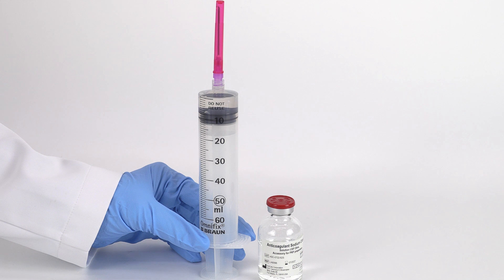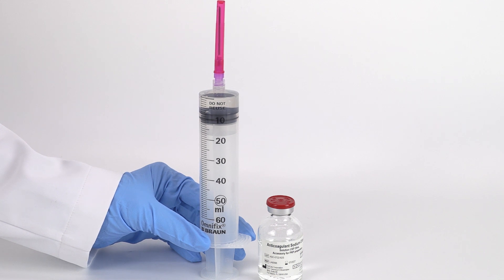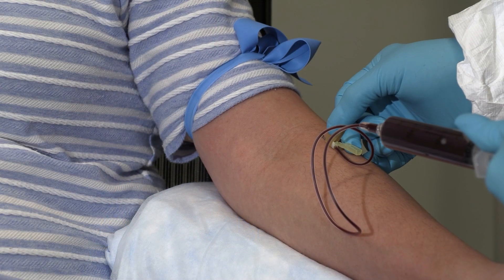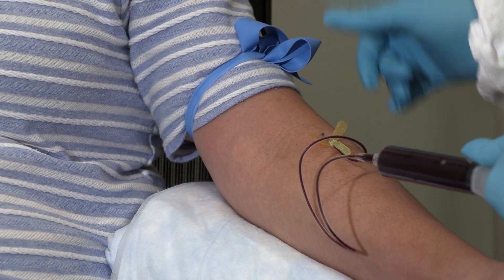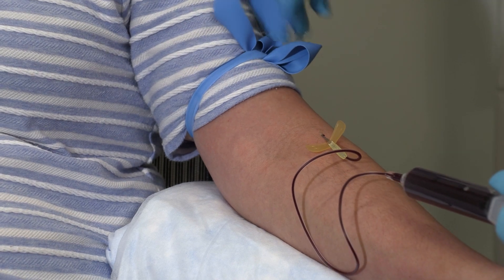Fill a 60 milliliter sterile syringe with 8 milliliters of citrate anticoagulant. Then draw 52 milliliters of blood from the patient, filling the syringe to 60 milliliters.